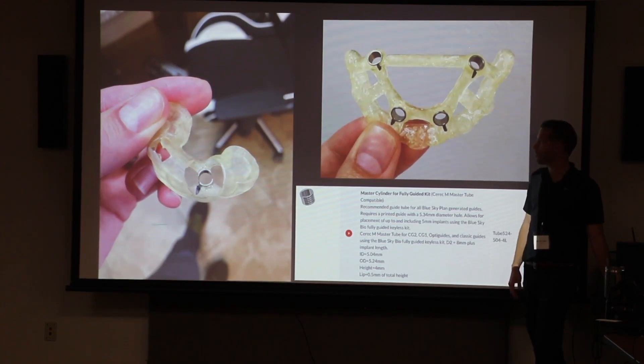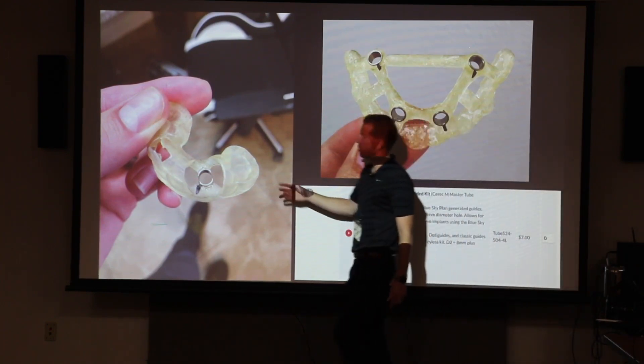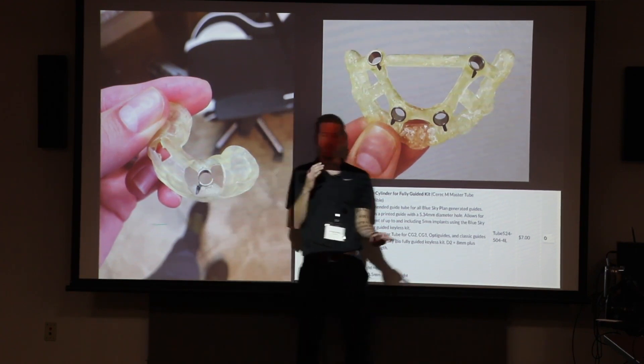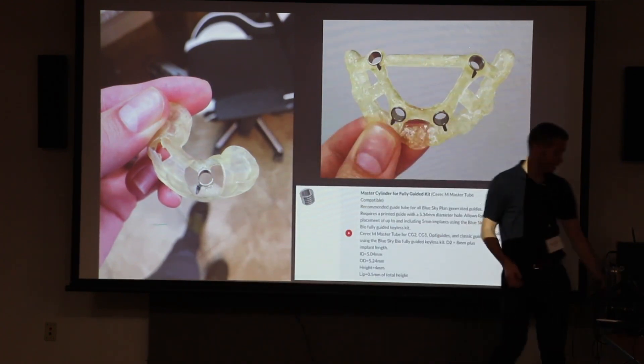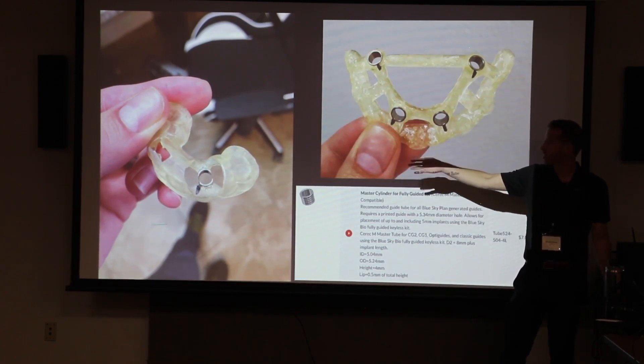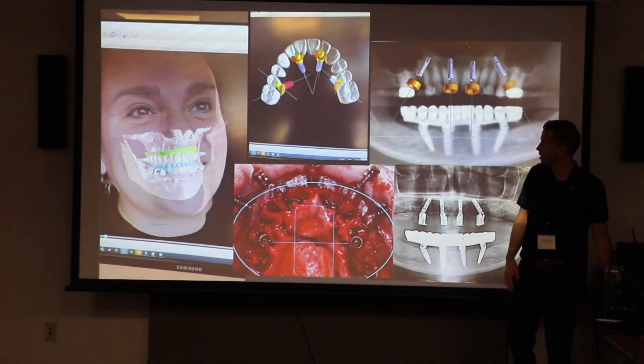That's just the title, the one that's defaulted. But also in tight spaces — a lateral incisor — a metal sleeve even adds a little lip outside there. So sometimes you've got to get creative as far as how you're going to fit this into tight spaces. Increasing the offset would be one way. That one I kind of trimmed the lip a little bit. So each one's kind of getting creative.